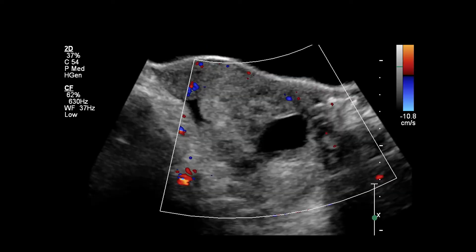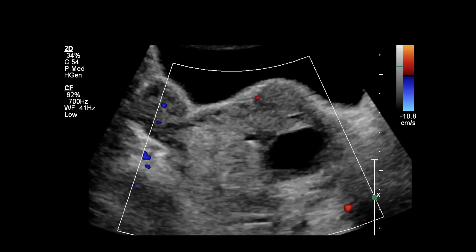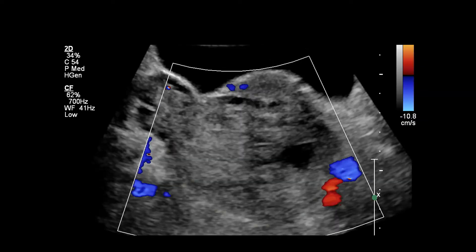When we add color Doppler, concerningly we don't see any internal flow within this enlarged ovary. We add power Doppler because that typically has more sensitivity, but we also see no internal flow within the ovary. As we continue to interrogate that enlarged heterogeneous left ovary, we don't see any internal vascularity.